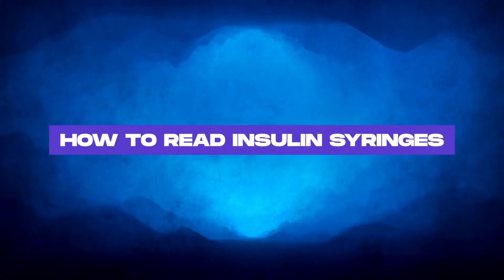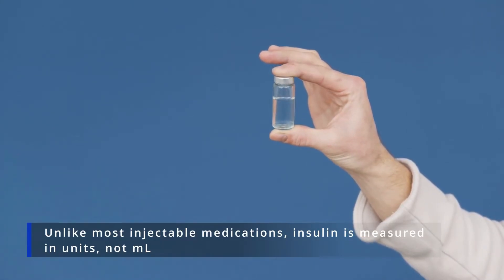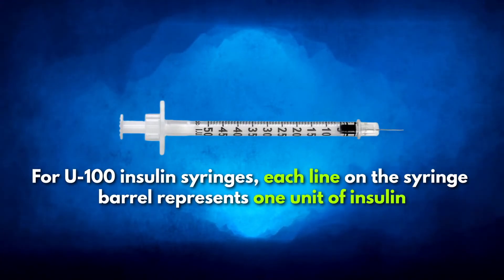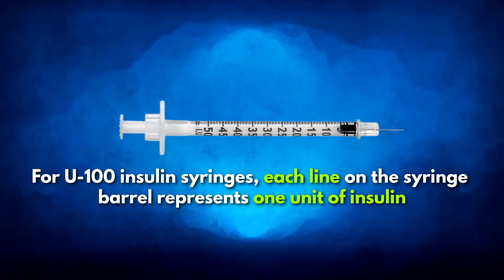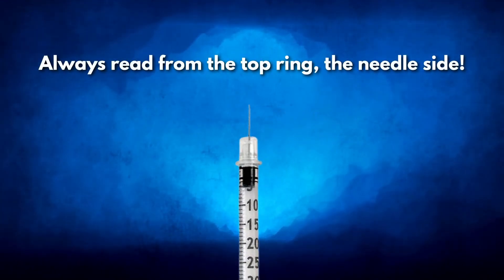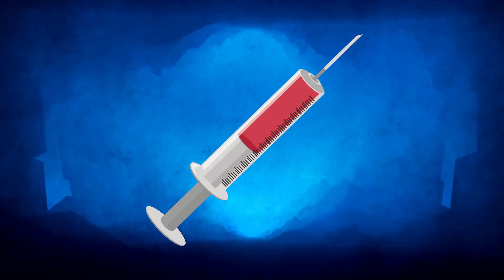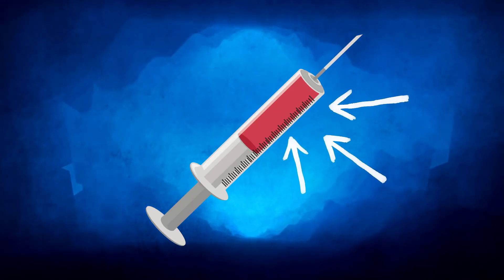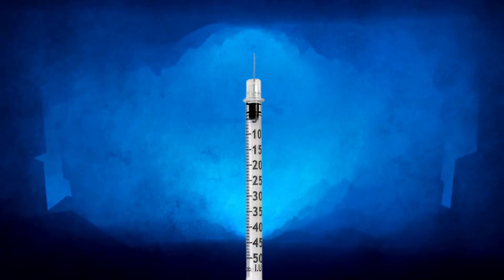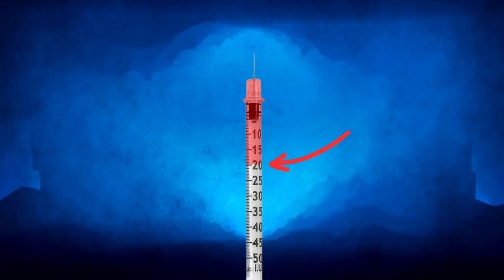Unlike most injectable medications, insulin is measured in units, not milliliters. The numbers on an insulin syringe indicate the number of insulin units. For U100 insulin syringes, each line on the syringe barrel represents 1 unit of insulin. When drawing insulin into a syringe, always read from the top ring — the needle side. Once you have identified the increments on the syringe barrel, you can measure the amount of insulin by counting the number of lines from the needle end to the desired amount. For example, if you need to measure 20 units with a U100 insulin syringe, you will draw the plunger to the line marked 20 on the syringe barrel.